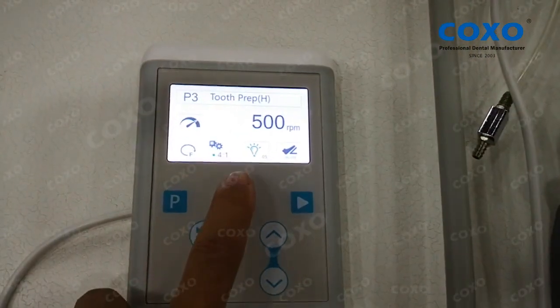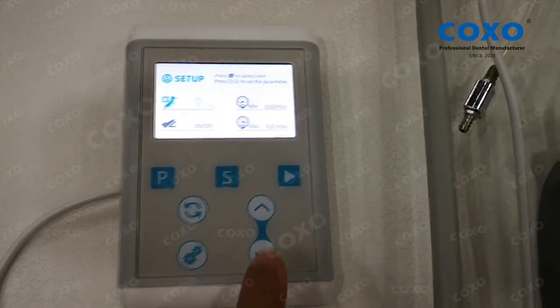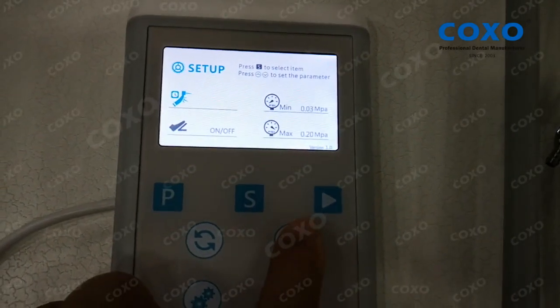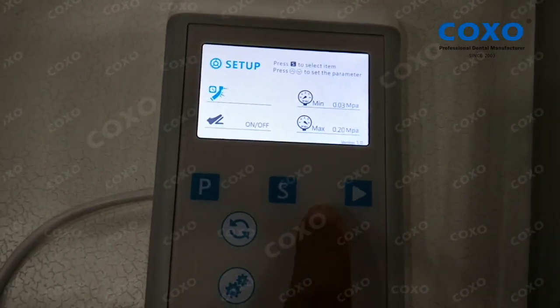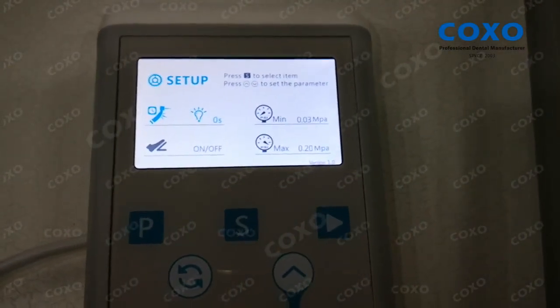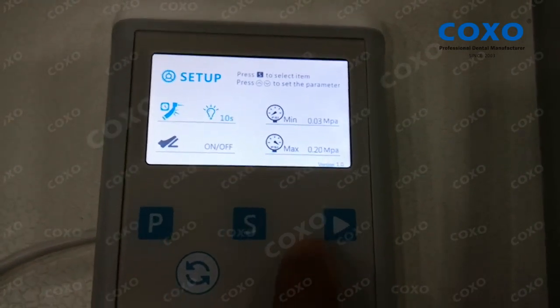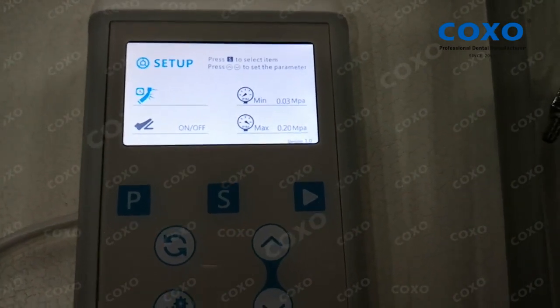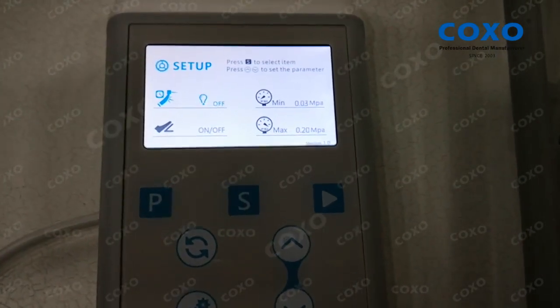This set button is on-off. Touch it for three seconds and you can set the light. Just zero seconds means when the motor is off, the lights will turn off also. But you can set five seconds or ten seconds to delay the light — meaning when the motor turns off, the lights stay on. And if you set it to off, it means no light.